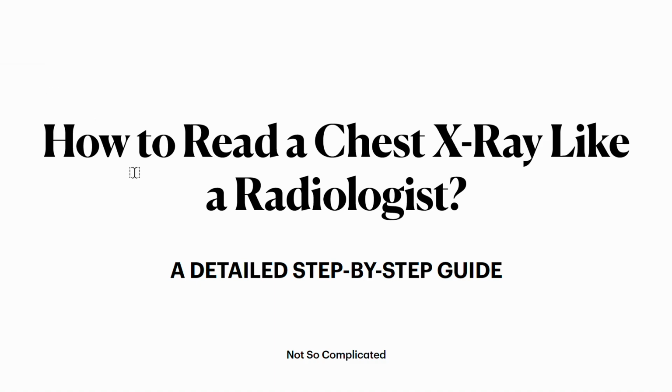Hey, welcome back to Not So Complicated, and today we are doing how to read a chest x-ray like a radiologist. Whether you are an MBBS student or MD student or any aspirant or a doctor or a patient, this video is for you because we all know that it has been a serious problem to not be able to read a chest x-ray, right? So I provide you a detailed step-by-step guide. Let's begin without further delay.